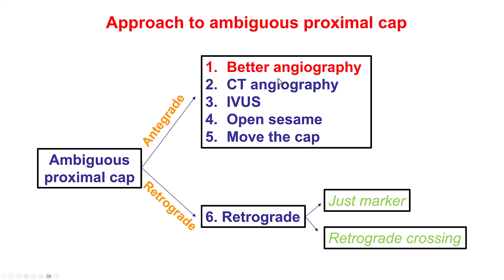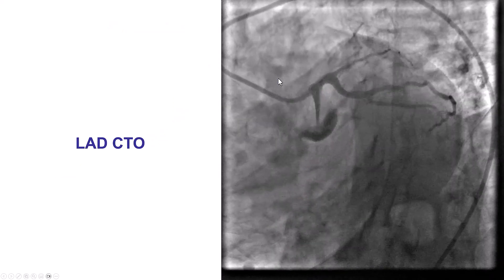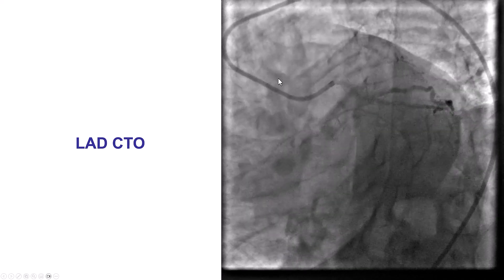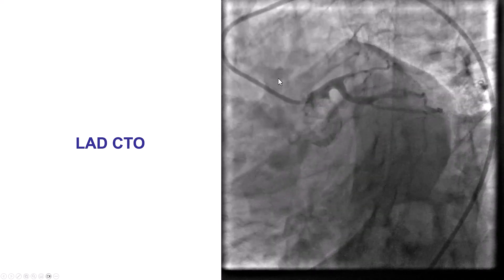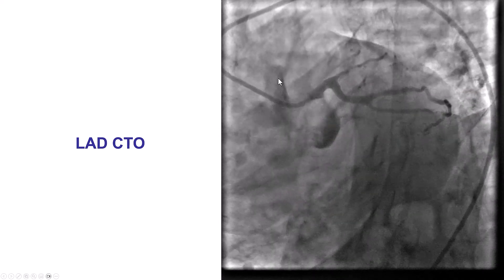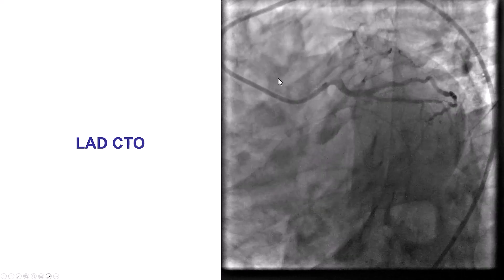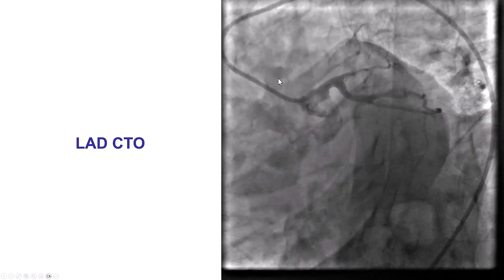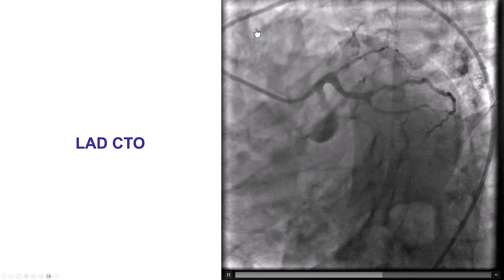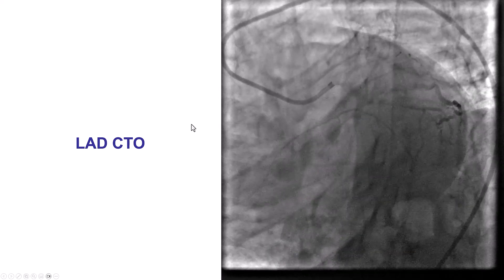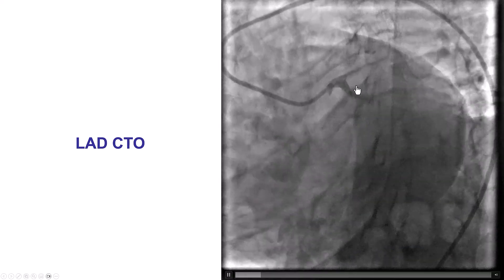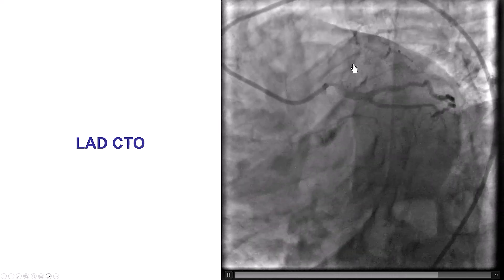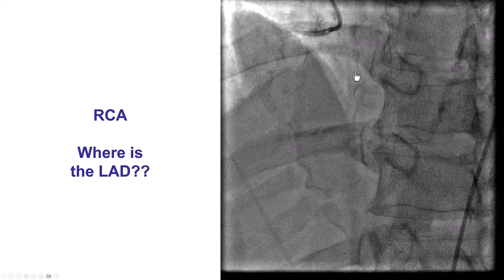Starting with the angiogram, the ambiguity of the proximal cap depends to a large extent on the interpretation of the angiogram, and more experienced operators may be able to decipher with higher accuracy where the location of the proximal cap is. This is an example of an LAD CTO that continues into the diagonal branch; it is unclear exactly where the occlusion starts.